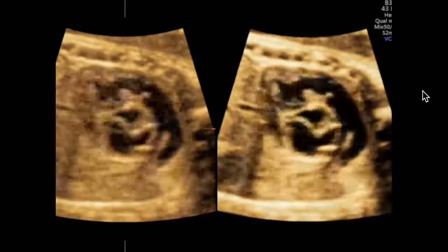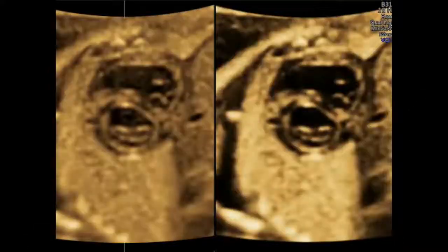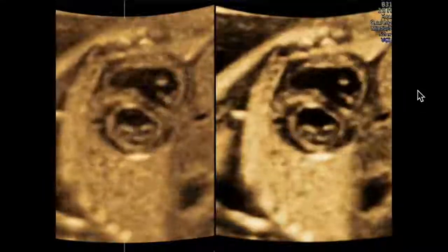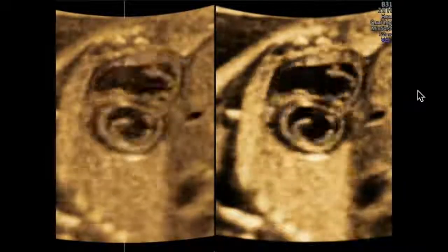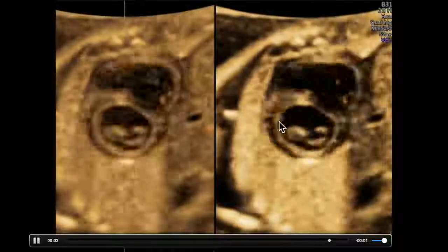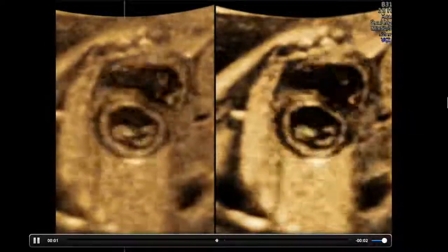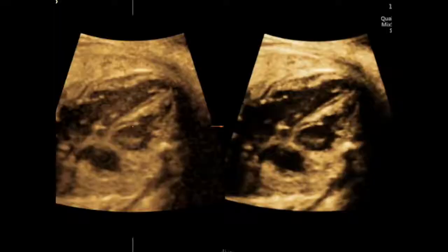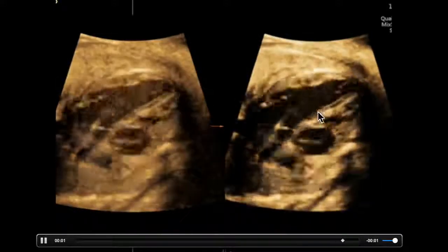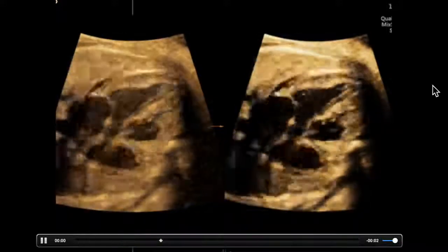Better assessment of ductal arch and vasculature, especially LPA and ductal branches. Here, Norm should love this one. This is how tissue contrast between two tissues that often appear isoechoic is improved with this. Norm talked yesterday about the ratio of compacted to non-compacted myocardium, and I think you can see that this technology really enhances your ability to pick that up. Here again is a VSD with your 2D eye that you're going to pick up without the benefit of color flow by using this.